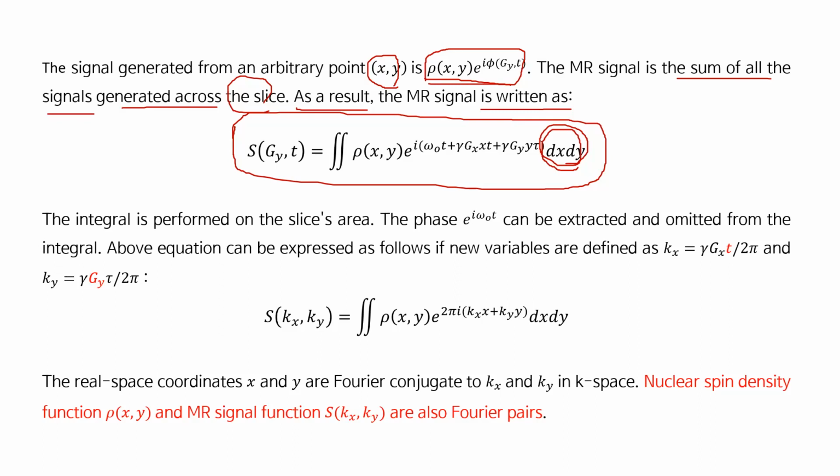So we have to do the area integral in the slice plane. And here the phase change is given by this form.